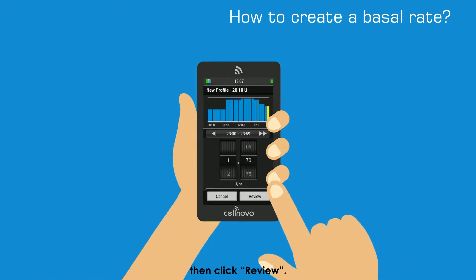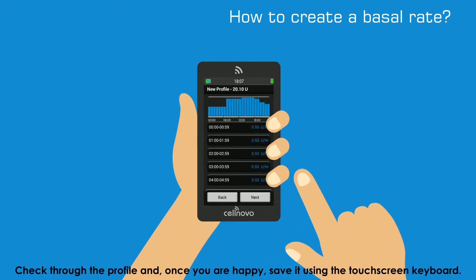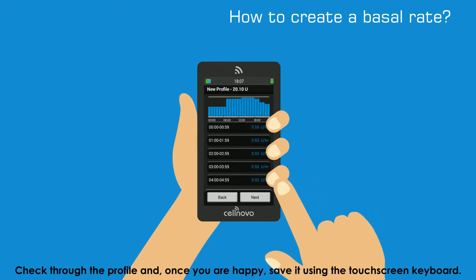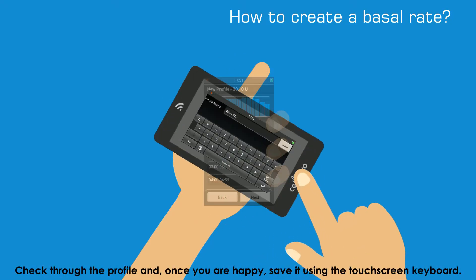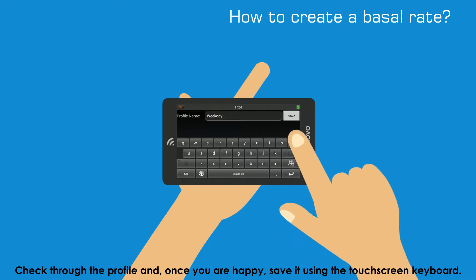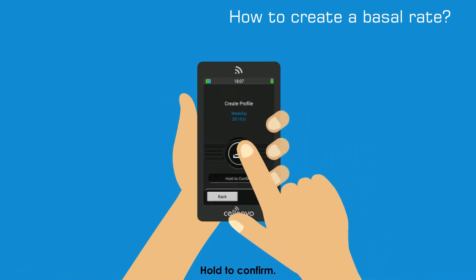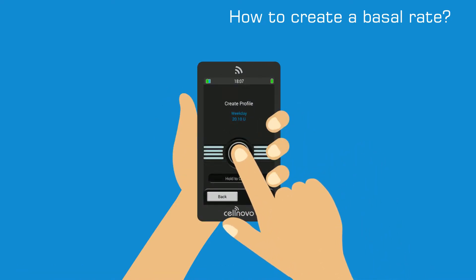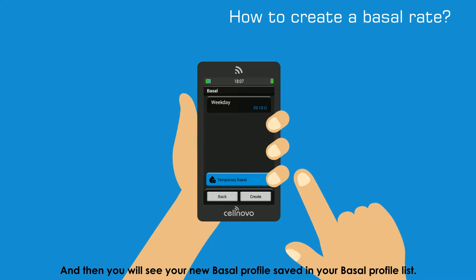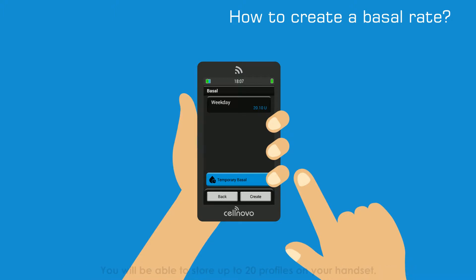Then click Review. Check through the profile and once you are happy, save it using the touchscreen keyboard. Hold to confirm, press OK and then you will see your new Basal profile saved in your Basal profile list.